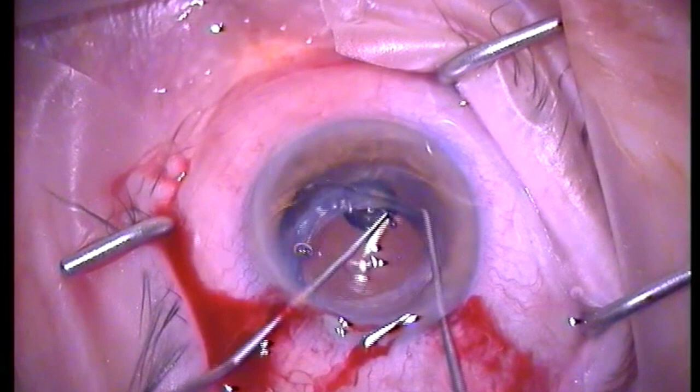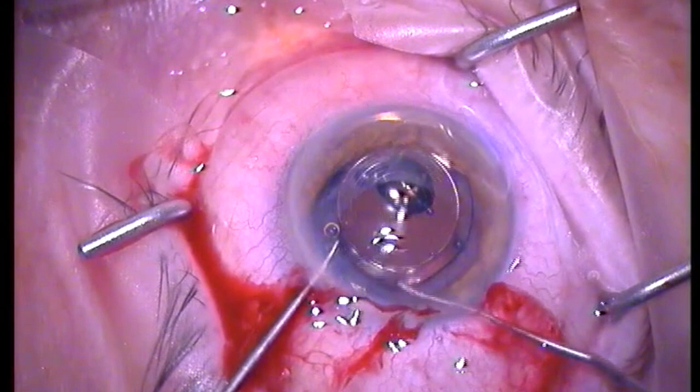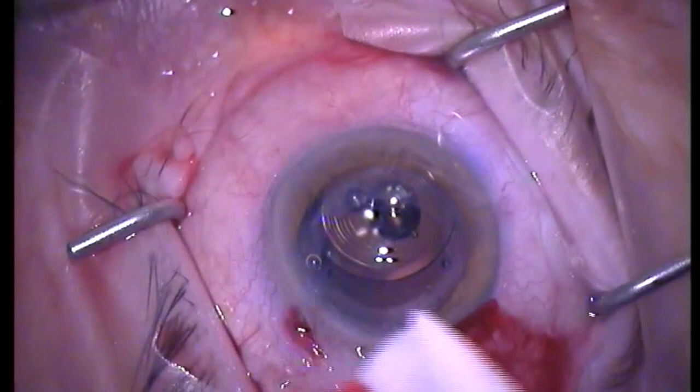Because of the nature of the lens being hard, I always flex its edge a little bit so that it doesn't stretch the capsule too much.